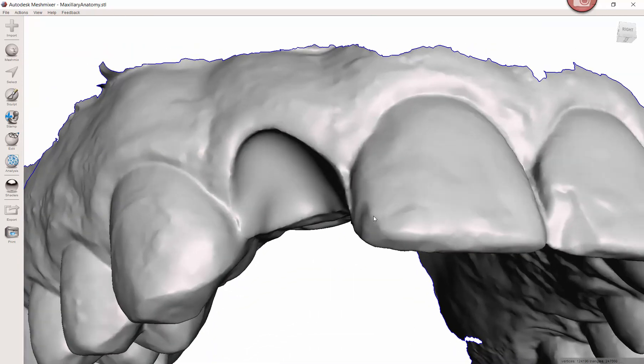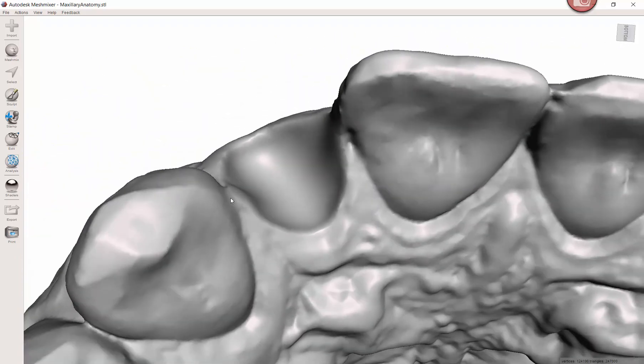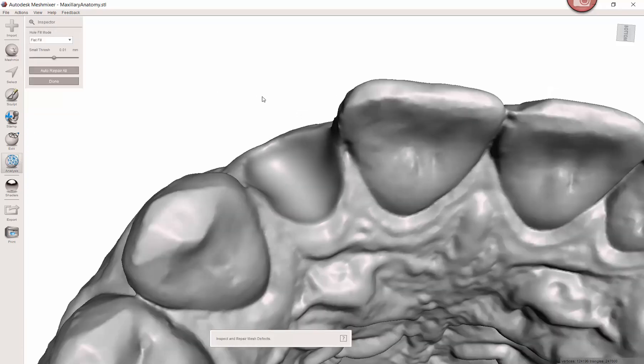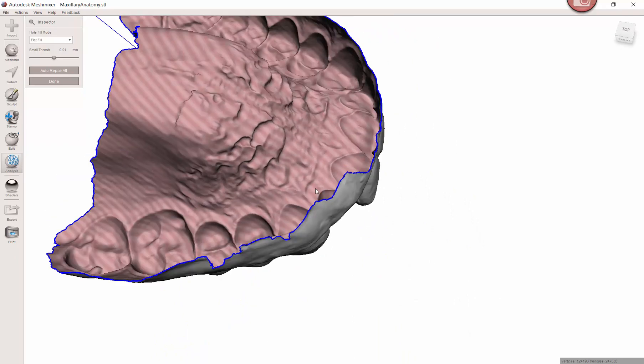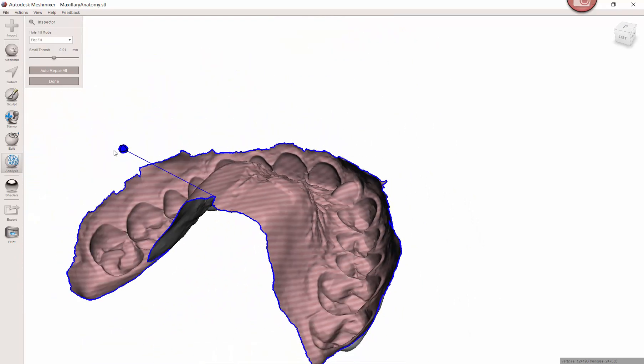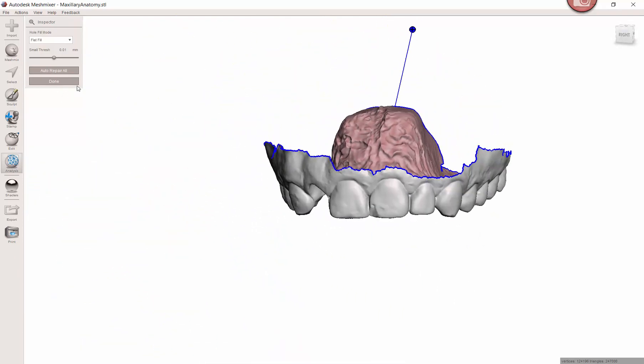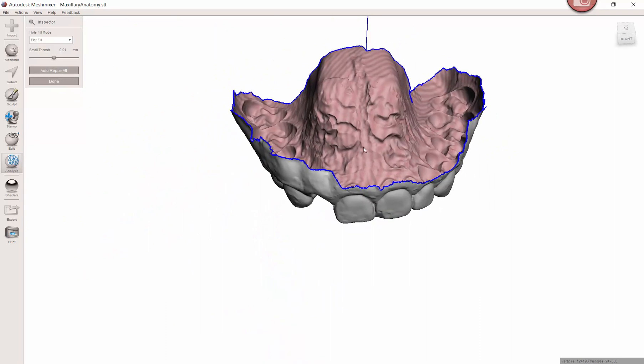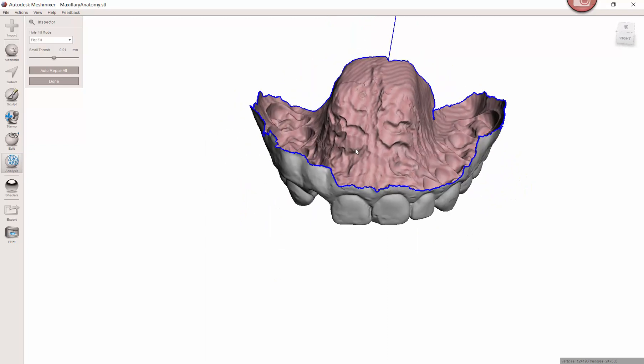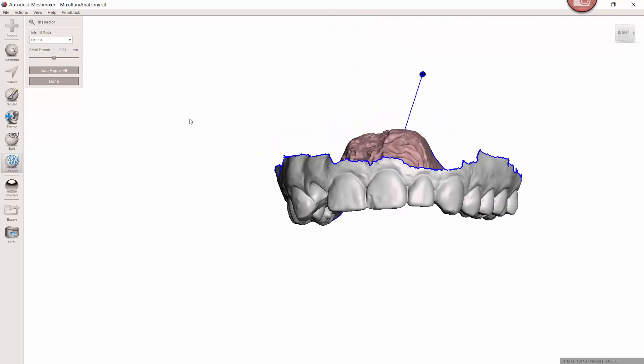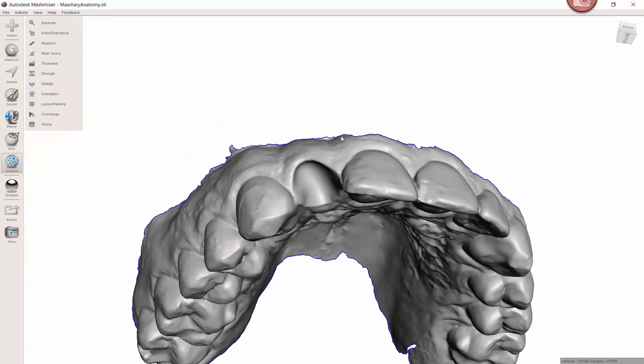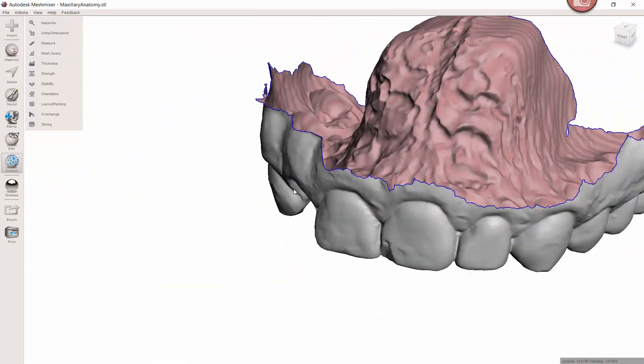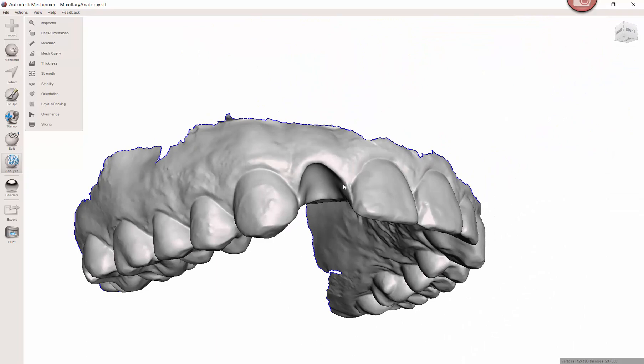When I adjusted that, that little red dot right here went away. If that was still there, I would just go to analyze inspector and it would show me where any flaws are. There is technically a flaw because it's an open model. Do not hit auto repair all or click on this globe because it's going to try to close this off and it's going to look like a mess. I have other tutorials on how to base this model if you want to print it.